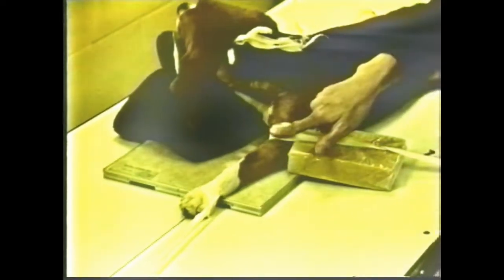Proper positioning for the cranial caudal view of the elbow or antebrachium is demonstrated next. The head is moved to the side so there's no superimposition of the neck area. The leg is extended cranial. The elbow is taped and pulled laterally so that the true straight position of the humerus and antebrachium can be maintained.